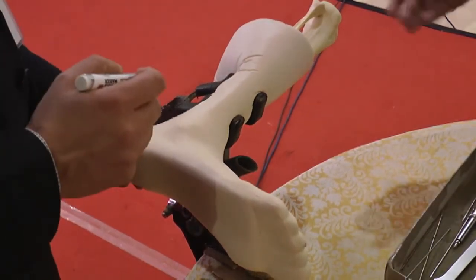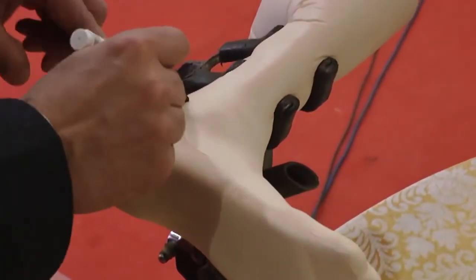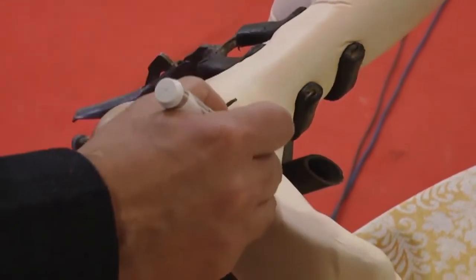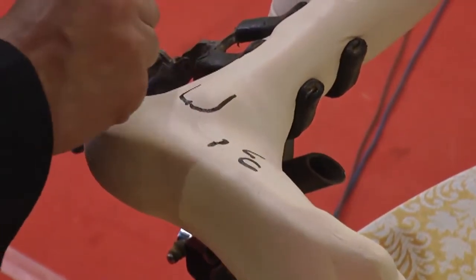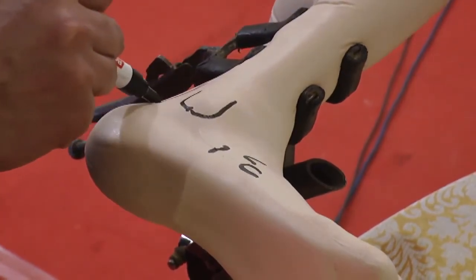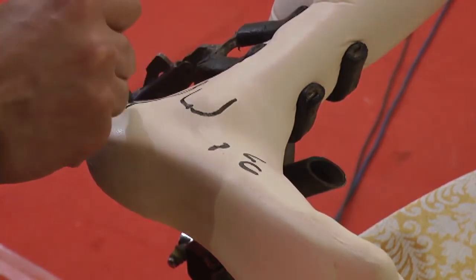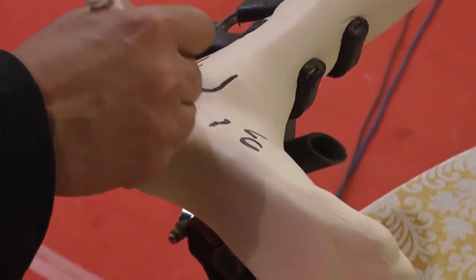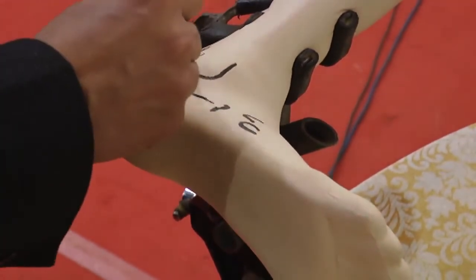So in the lateral position, this will be the tendo-Achilles area, and that is the marking of the fibula, and that is the base of the fifth metatarsal, and that is the fourth metatarsal, and this will be the calcaneocuboid joint. And here the important structures that you must be aware of are the lateral calcaneal branch of the peroneal artery, and just in front of that is the sural nerve. So that is the sural nerve, and that is the lateral calcaneal branch.